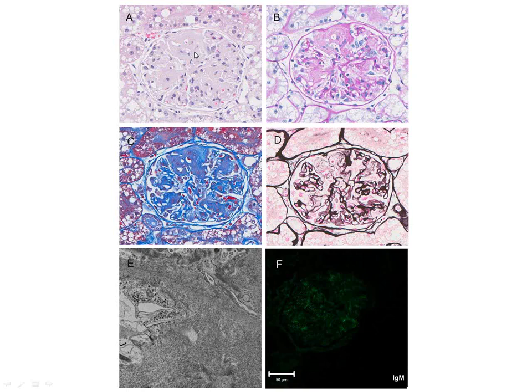Okay, so I see in panel A, which is the H&E, that we have some mesangial expansion. I do see a few open capillary loops. Yeah, that 12 o'clock spot. But it's mostly homogeneous in that area. And then on PAS, it's PAS positive. Like I said, it seems more like mesangial matrix than cellularity. I think the cellularity is probably appropriate throughout the glomerulus.